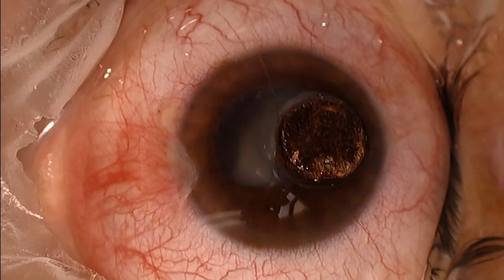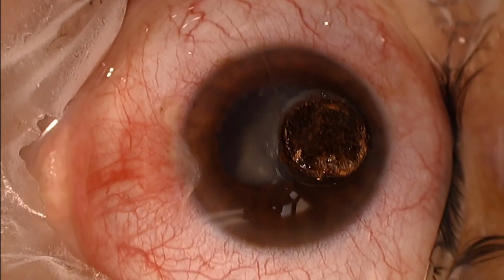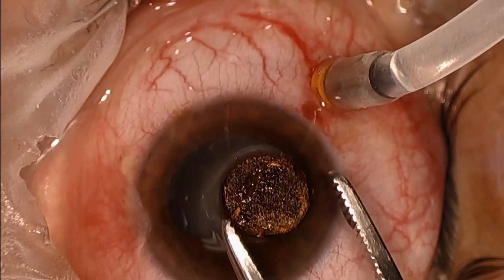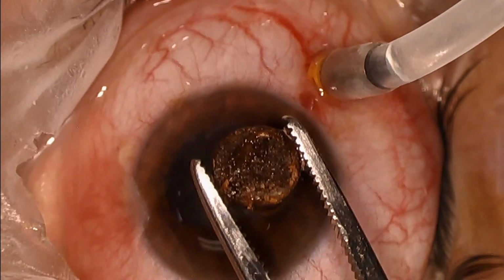So this gentleman was outside using a chainsaw cutting up some wood when all of a sudden he felt a sharp pain in his eye. So you can see that there's a large nail there and we're about to remove it. And here it goes.